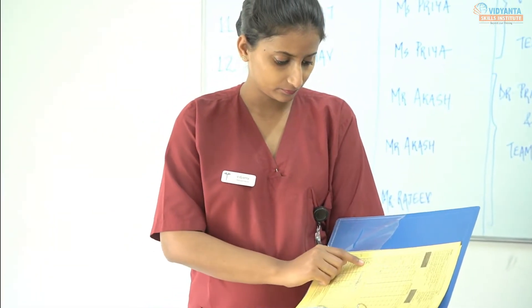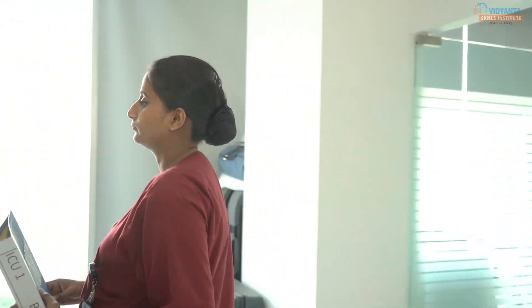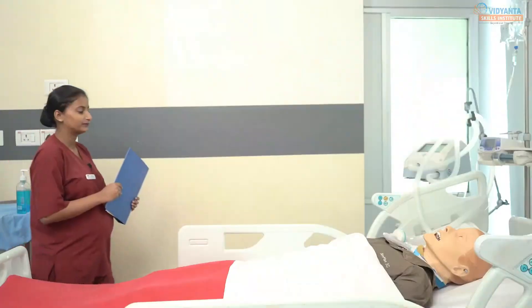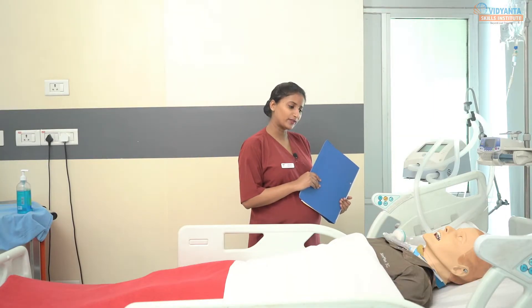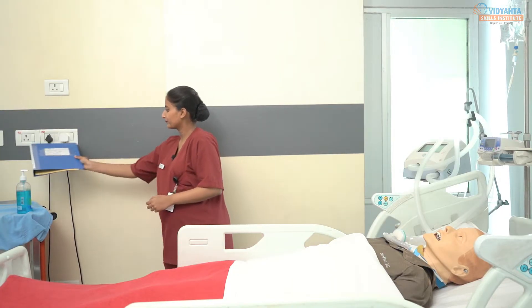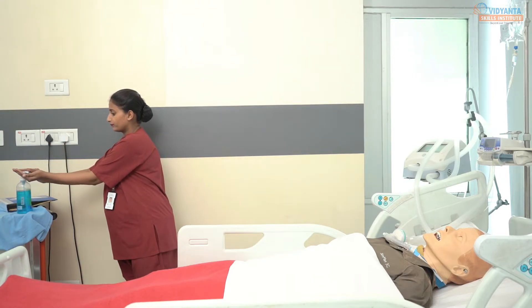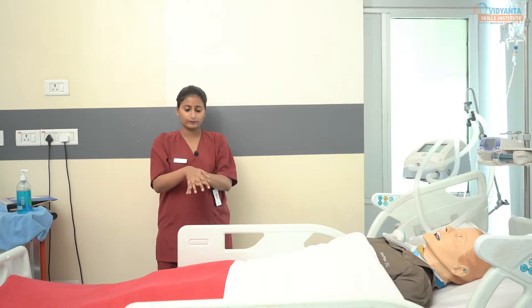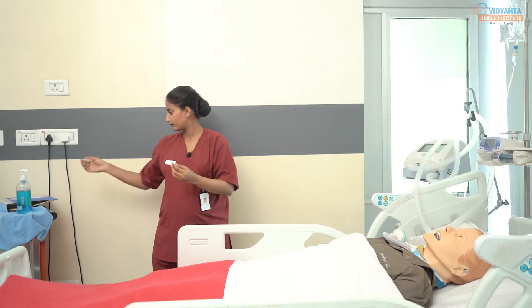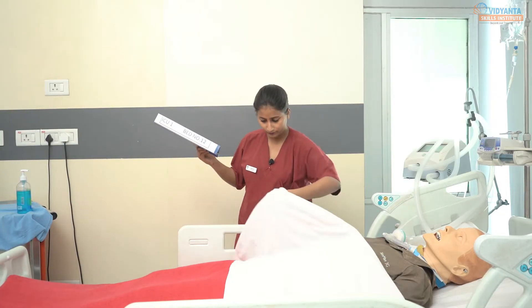Enter the patient room and introduce yourself to the patient. "Hello, good morning sir. My name is Priya. I am your assigned staff nurse from 8 a.m. to 2 p.m." Check the patient's identification by checking their wristband. Always follow the 5 moments of hand hygiene. Explain the procedure to the patient — even if the patient is unconscious, explain the procedure as the subconscious mind of the patient is awake.